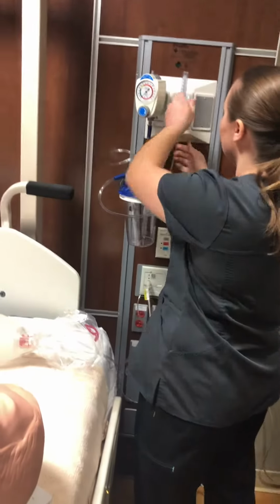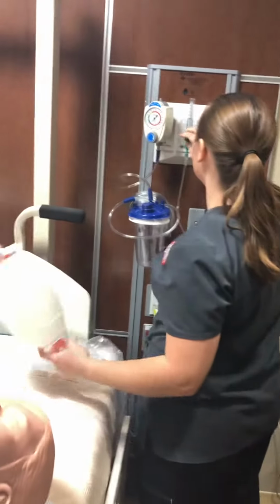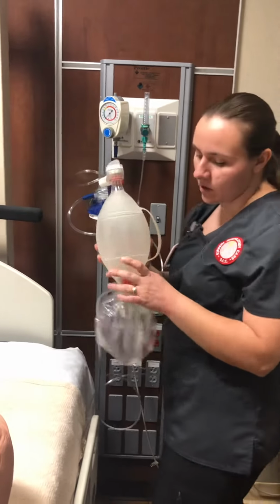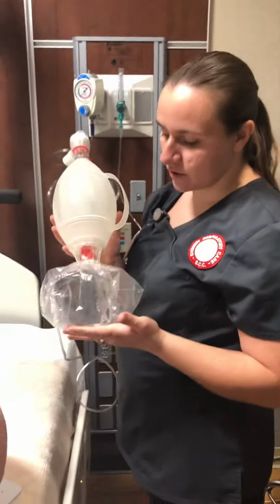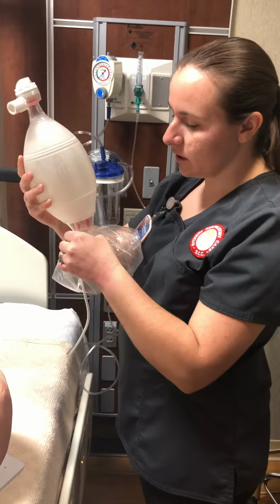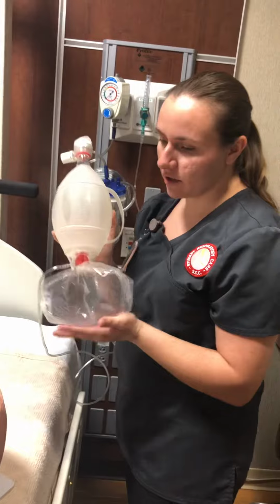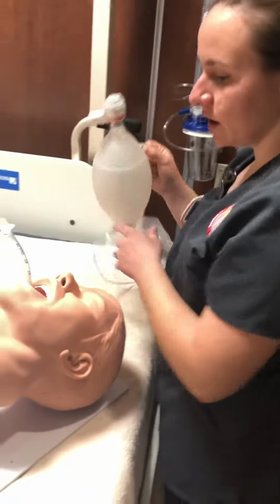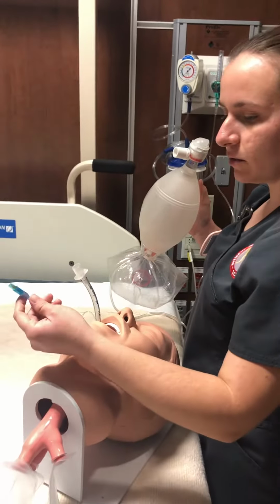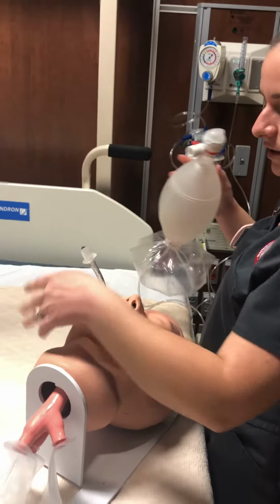So I attach it to the adapter here, and then I turn it up to 15 liters per minute to get a good flow. Then I need to wait to make sure this bag properly inflates. Make sure there's no kinks in the tubing, and make sure the bag inflates before I place it on. Before I place it on, I always check the balloon, make sure the balloon is properly inflated and there's not going to be any leaks.